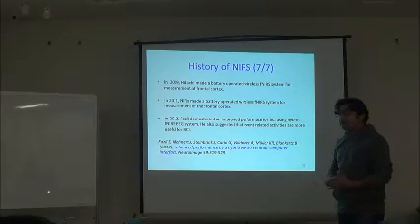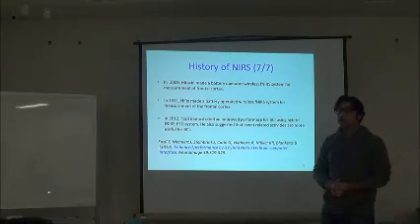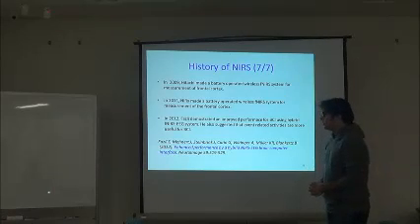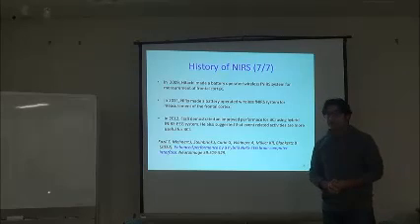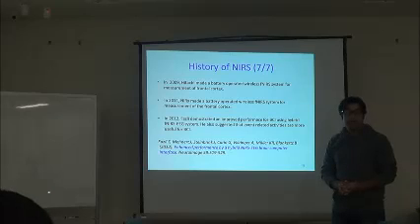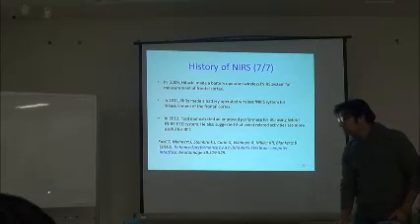It was shown that for brain-computer interface, using fNIRS plus EEG, we can get better results, enhanced performance. Also, it was suggested that in the case of fNIRS, it's better to use event-related activities rather than simple activities. So this is the reference.